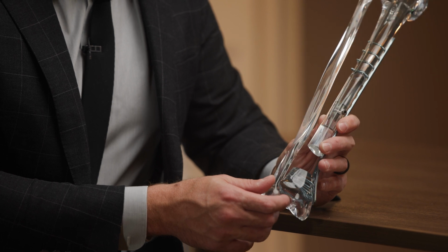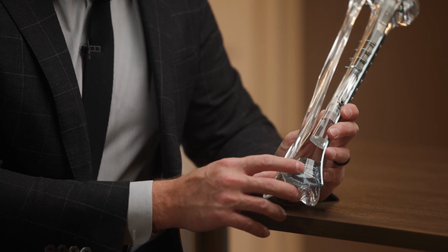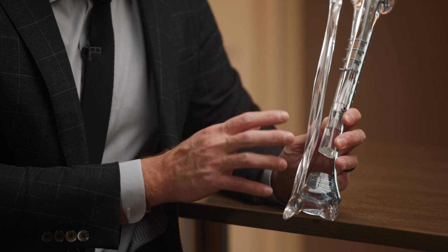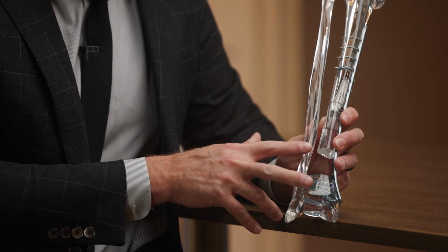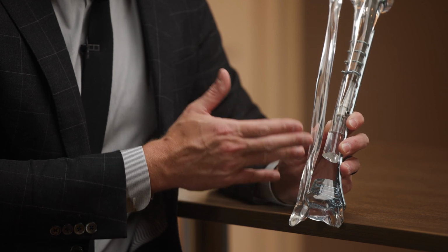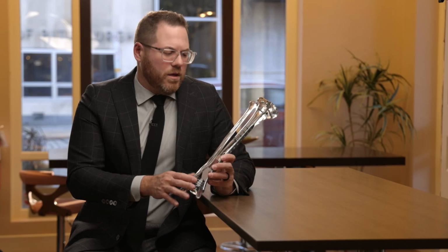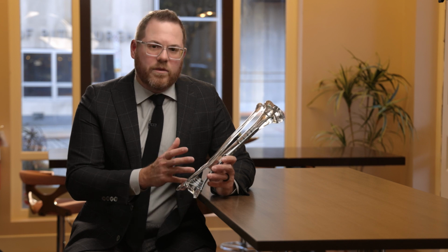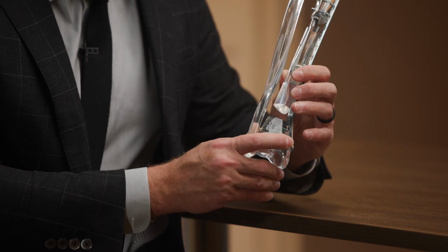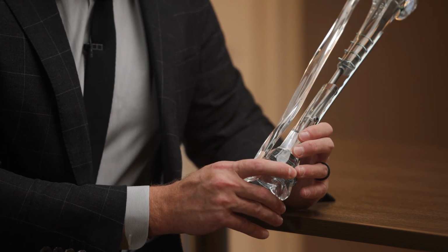The other thing that's important to consider is the size of the defect. I like to plan these cases with the defect that I believe will be the case, as well as a contingency plan should the defect be larger. This is important based on the length of the nails. There is a varying degree of excursion that the nail will telescope, so it may be important for your case to have multiple different lengths and diameters available.